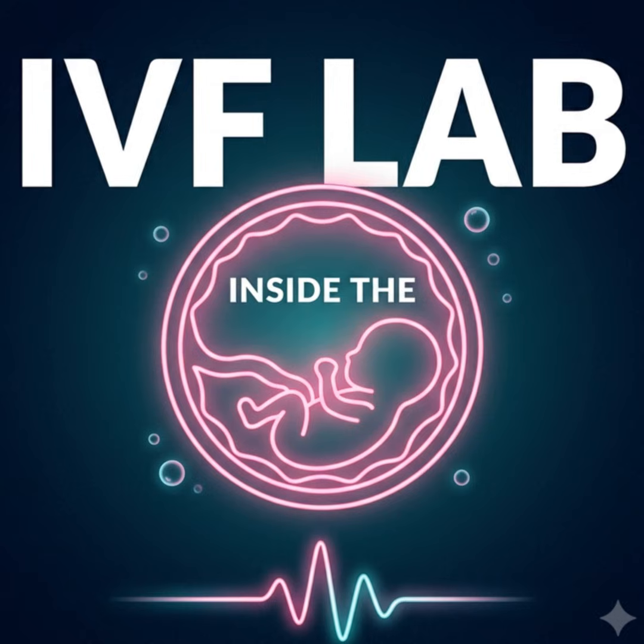Modern oocyte vitrification is a phenomenal scientific achievement. In a high-standard laboratory utilizing flawless technique, we expect survival rates, meaning the egg survives the thermal jump and the step-down rehydration process completely intact, to hover between a highly successful 85 to 95%. Which is an incredible leap from the dark days of slow freezing, where survival was essentially a coin toss. Oh, night and day difference. 85 to 95% survival is fantastic. But survival simply means the cell didn't shatter. Survival does not equal a guaranteed pregnancy. No, survival is merely the first, albeit critical, step across the threshold.